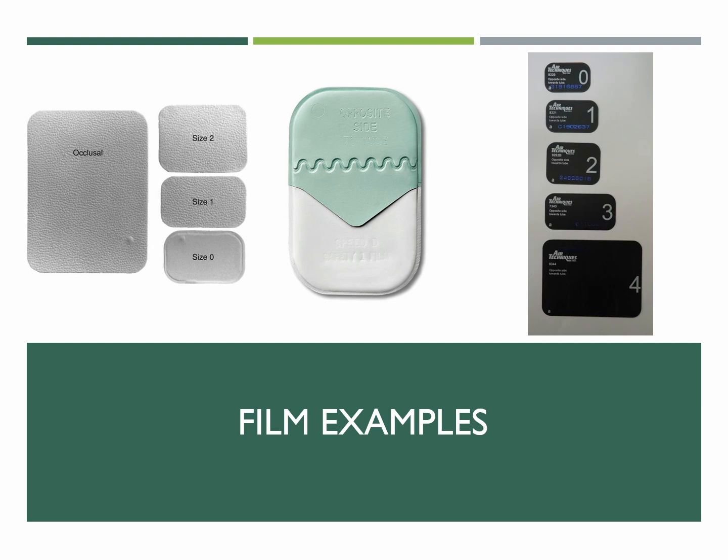The film to the left is actually traditional film. So you can see that it's kind of a bluey green or robin's egg blue. You would pull that tab once you have it in a safe, dark area to expose that film to process it. It comes in different sizes, 0 to 4, 0 being the smallest, 4 being the largest. And as you're going to learn going on, the size is really dependent on the tooth you're taking and the size of the animal and how you can fit it in the mouth. Remember, those pesky palates get in the way sometimes.